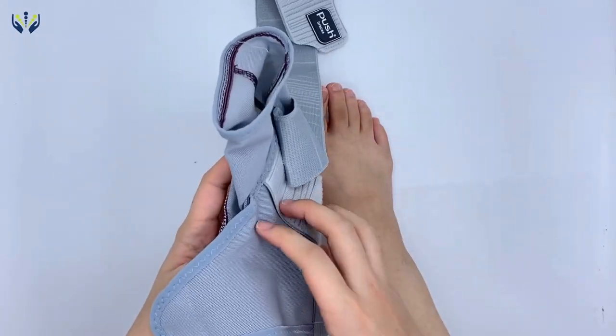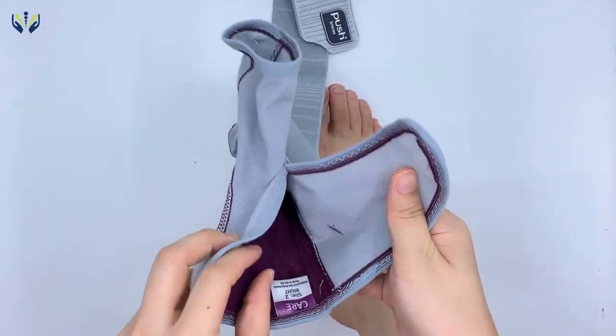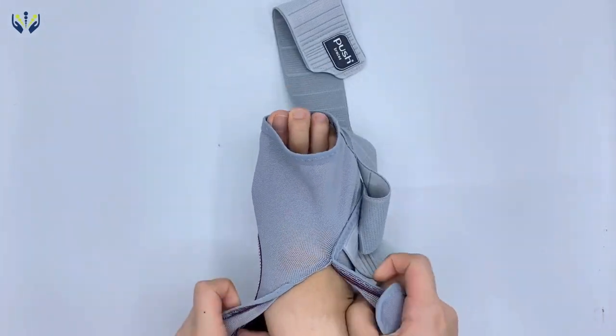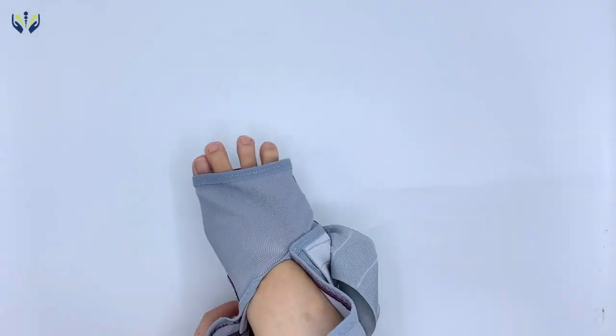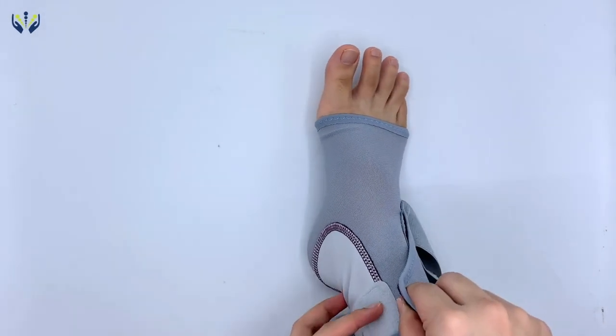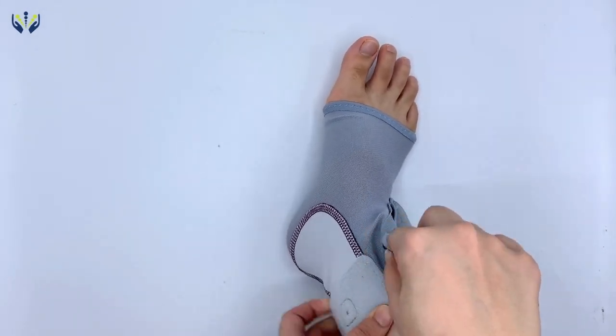This ankle brace is quick and easy to wear, allowing you to strap it on in a matter of seconds. All you need to do is slip into the internal sleeve, then bring the straps around the ankle. The strap can be adjusted to be as loose or as tight as you require it.